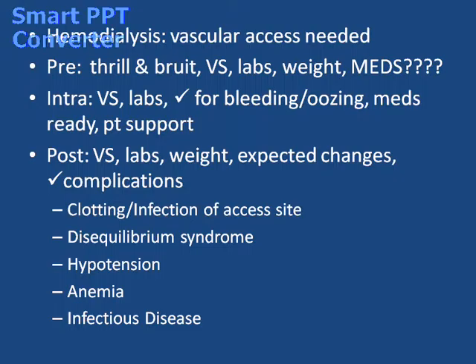Hypotension is another complication of hemodialysis, and that's rapid fluid depletion during dialysis can cause it. It also could be caused if the patient got their antihypertensive, or if they have some vasodilation going on because they ate prior to the dialysis. So that could cause their hypotension. So we're going to carefully replace the fluid volume, a slow exchange rate.